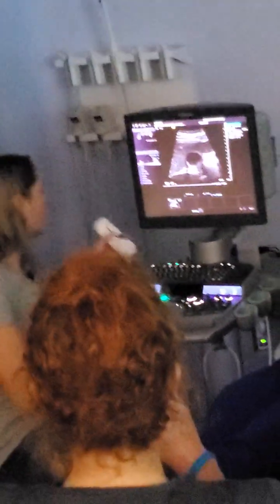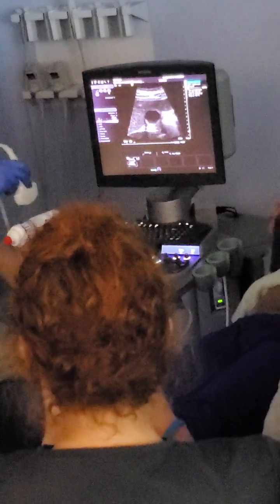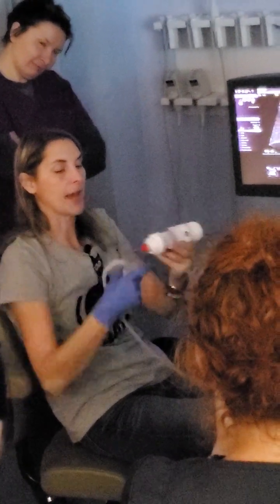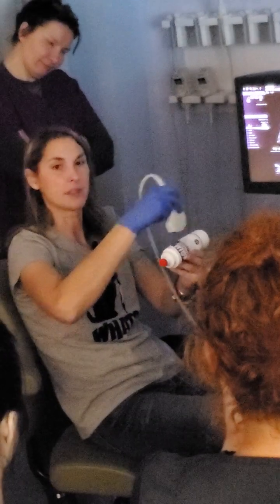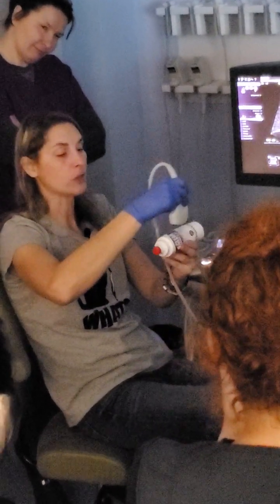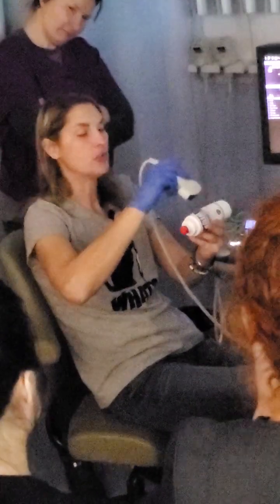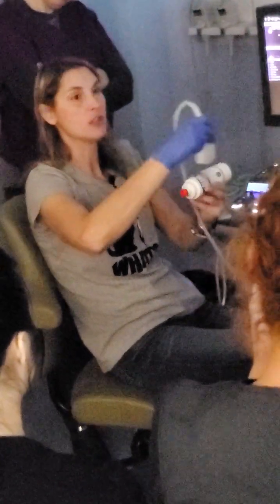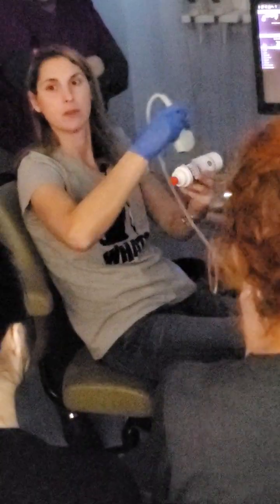The other thing too is when we're evaluating this gallbladder and we're looking at it in sag, I'll get my 1 sag image, and I'm not just going to repeat that same sag image. As I sweep through, sometimes there's polyps on the lateral sides, and they're really difficult to see when I'm just sweeping through. So I need to maybe move even just a centimeter just to sweep the wall a little bit differently to make sure that there wasn't any pathology that was missing just because I was right on those walls. So don't be afraid. Your first sag would be here, second sag would be a little bit over here, and then you'll have one with the wall measurement on that image.